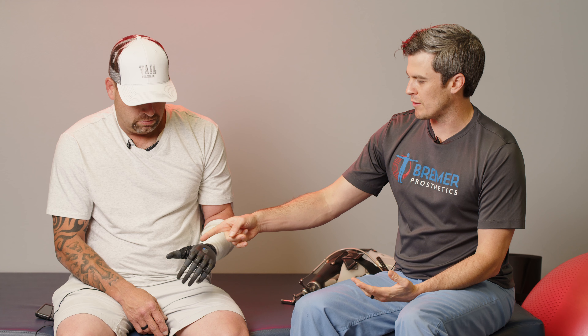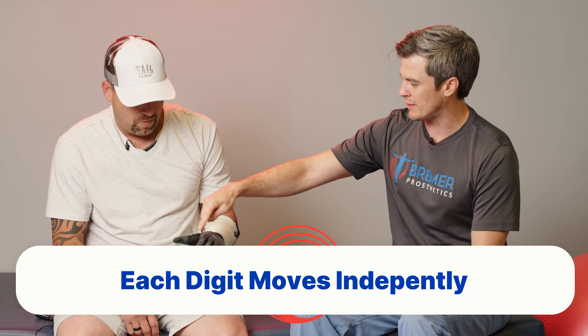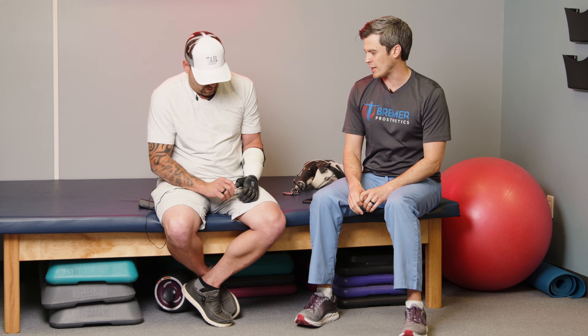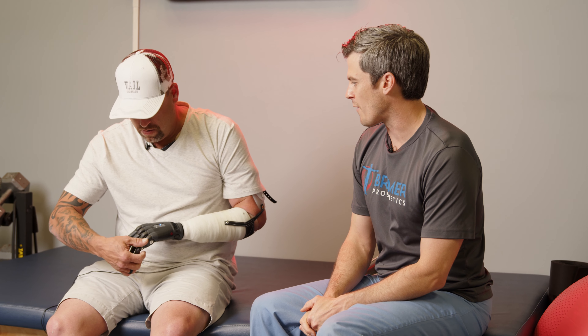One of the big things I like about this is that each digit moves independently. In the past, the myoelectric hands would basically be a three jaw chuck — two fingers and the thumb would move and they would make one grip pattern. So there's one thing you could do with them, that was it. With this, Jesse can do different things and change mode so that there are numerous grips — a whole lot of grips he could go through. And so it makes it a lot more functional.